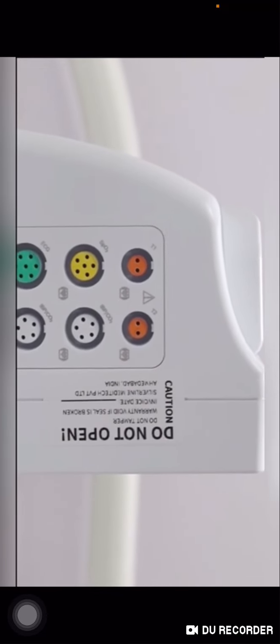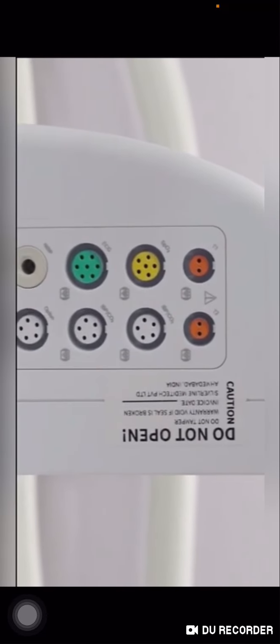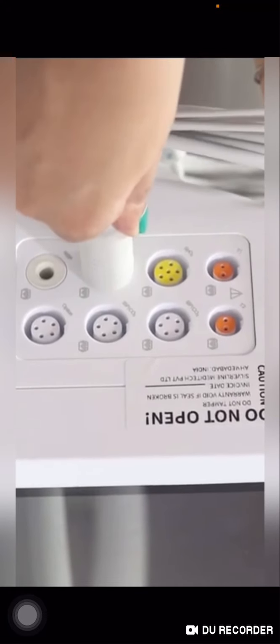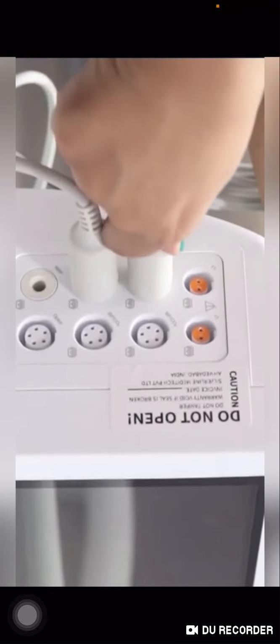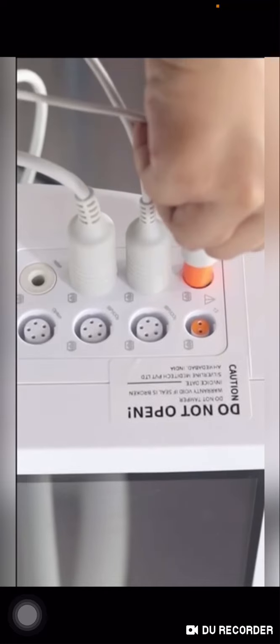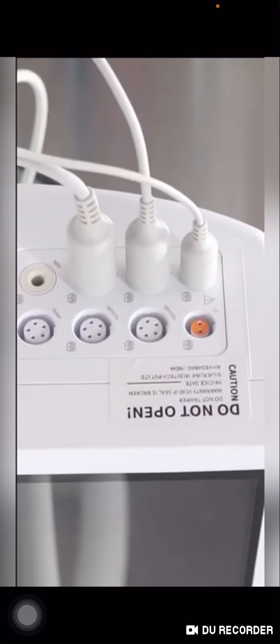What does the patient monitor contain? This is the installation of the cables and probes for the SpO2 and the ECG electrodes or leads to the patient. First, we install the leads one by one, each in its direction. Leads for the SpO2, leads for the patient, and the sensors, as is correct. This patient monitor gives precautions for a patient that has many sensors. Let's go for the working.